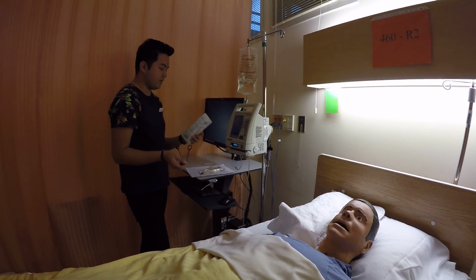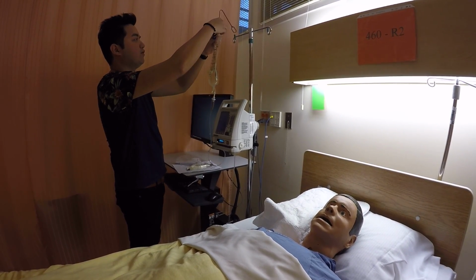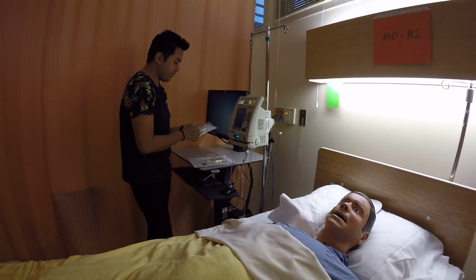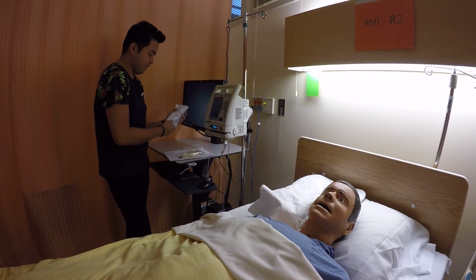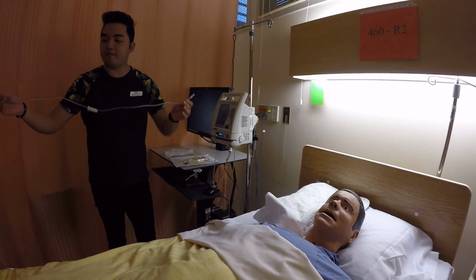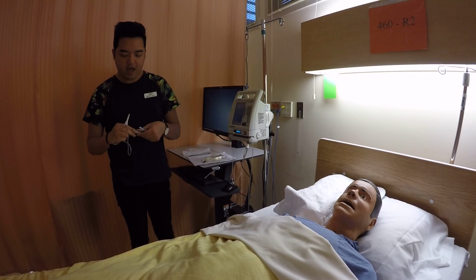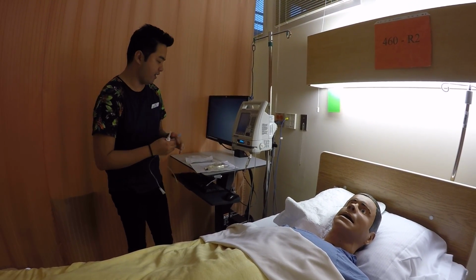So on my secondary set, I have this one. We just need to make sure that we hang the primary bag lower so that after our secondary bag is finished infusing, it would go automatically by gravity. And now we get the tubing. So for the tubing, we just need to make sure of the consistency, so there's no holes. All the caps are here, and then just make sure to clamp it before connecting, just to make sure the medication or any liquids won't splatter, okay?